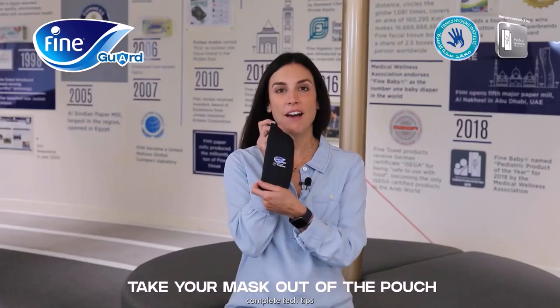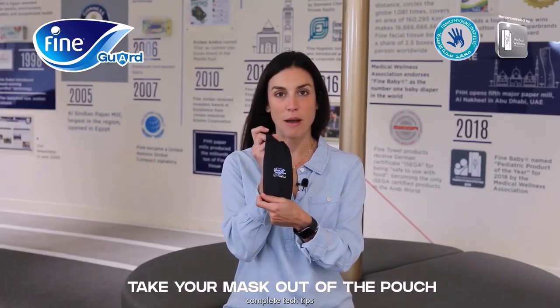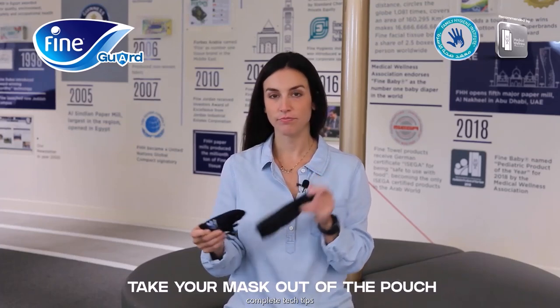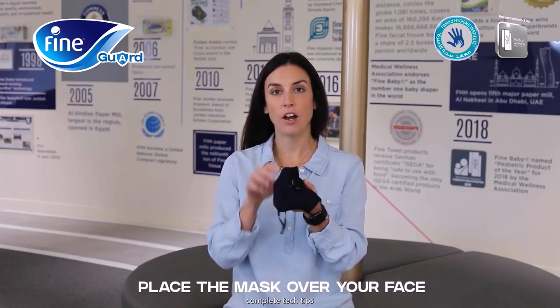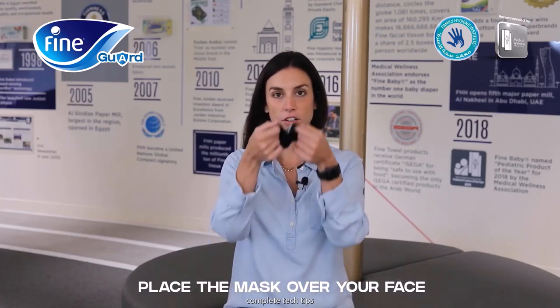Here we have the FineGuard face mask, which comes in a nice pouch. I'm going to take the mask out of the pouch and make sure that when I unfold it, I put the metal part over the top of my nose.